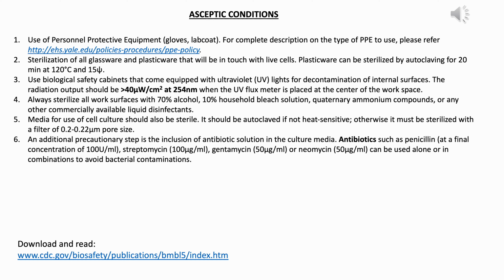Now, an essential requirement when working with cell cultures is to maintain aseptic conditions. Now, aseptic techniques essentially involve a number of precautions, and their aim is basically, there are two aims actually. One is to prevent the cultured cells from undergoing contamination, and the second is that the lab worker also gets protected against any possible infections.